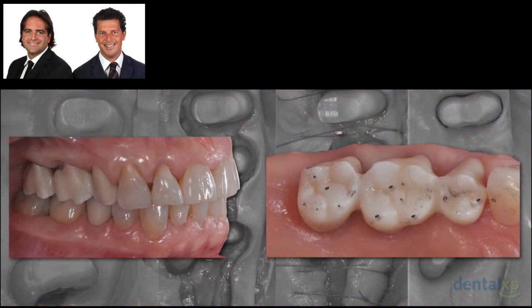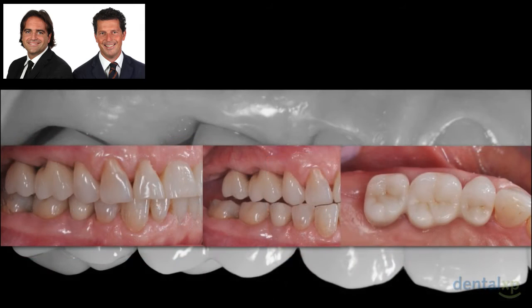But moving on with the case, we can see our framework. Our framework in this case is a monolithic zirconia, and you can see that the function is a replica of our temporary and of what we scanned before. The only layer that we left, the vestibular layer, is for the ceramization, for the veneering of the ceramic, in order to give more aesthetics to our patient.